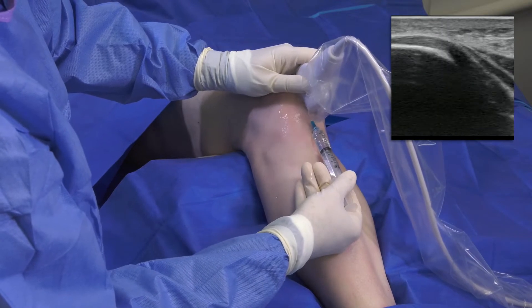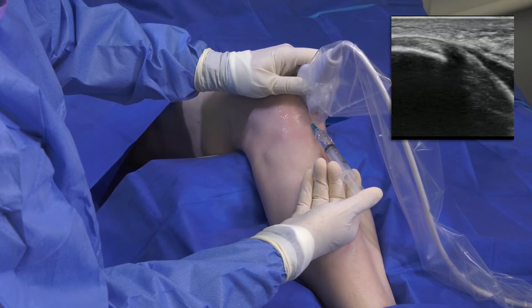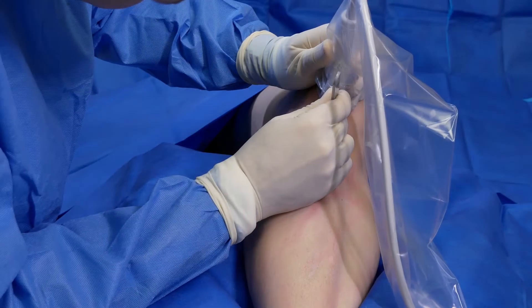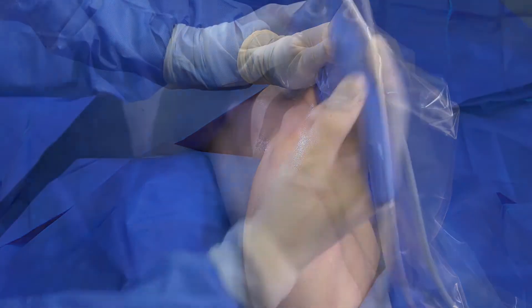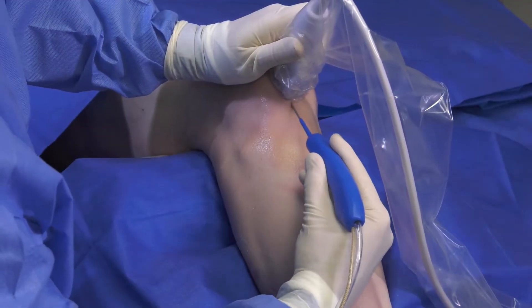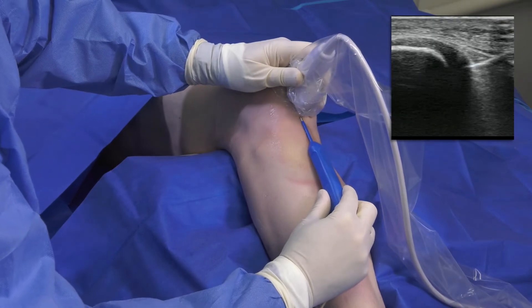I use the lidocaine to hydrodissect the overlying superficial tissue from the tendon to more clearly delineate the target tissue. Using an 11-blade scalpel, I make a small stab incision through the skin wheal, and once I've created a pathway, I guide the TenJet device toward the pathology while visualizing it under ultrasound.